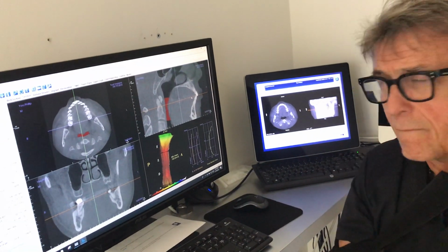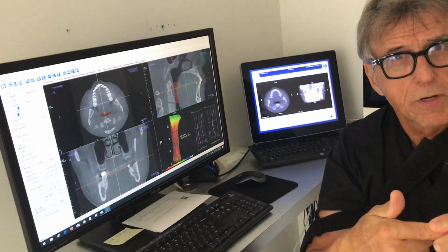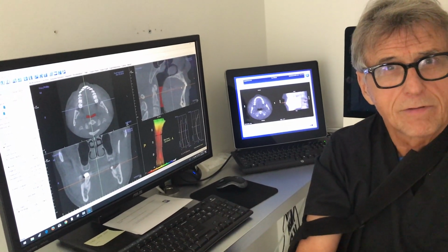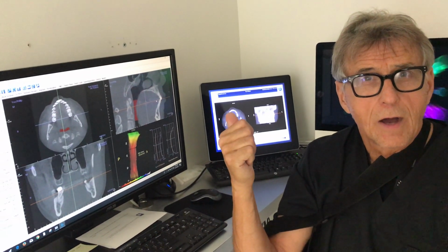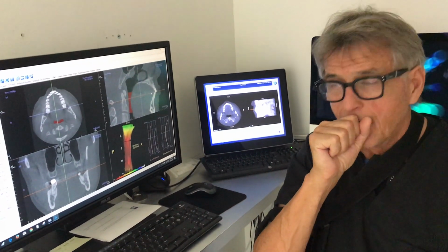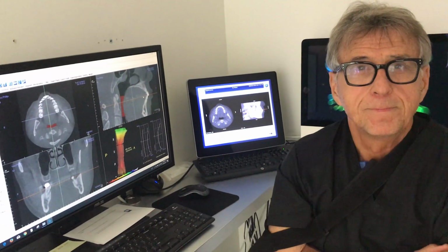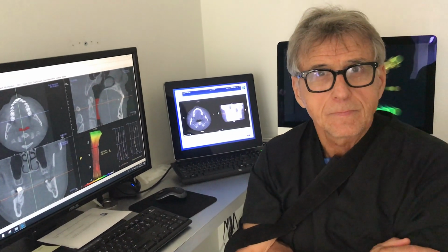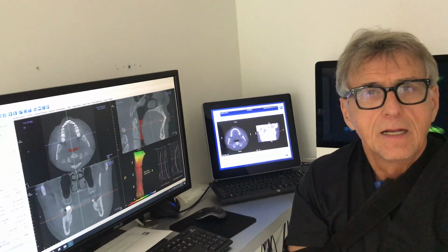Yep. So next thing for you is high resolution pulse oximetry. We'll have you wear that for 5 days, and we actually see what happens to your heart rate and your oxygen level when you sleep. I could even videotape myself at night and film me struggling breathing before I wake up at 2 or 3 a.m., right? You should be able to see that interruption in breathing patterns, right?